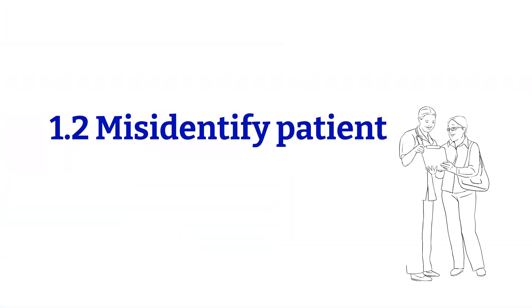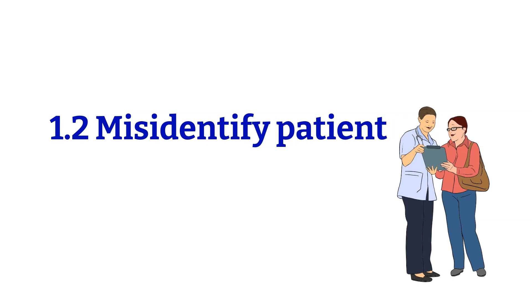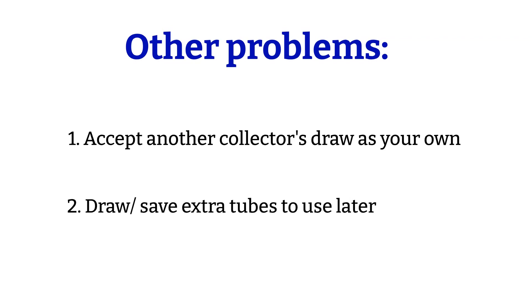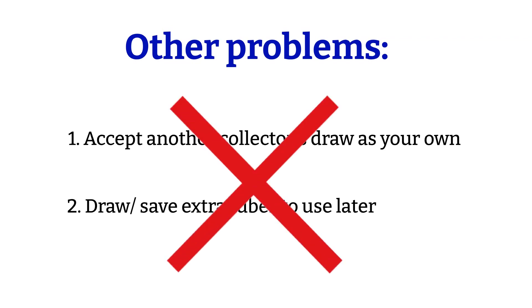Next, misidentified patients could be another reason why the current blood type and the historical blood type do not match. There is a right way and a wrong way to practice patient identification. As a healthcare professional, it is important to practice the correct way and not entertain the wrong way. A patient could die within a minute of getting a transfusion with an incompatible blood type. Keep that in mind. Other pre-analytical problems include accepting another collector's draw and labeling it as your own, or drawing and saving extra tubes for later use. These actions are unacceptable.